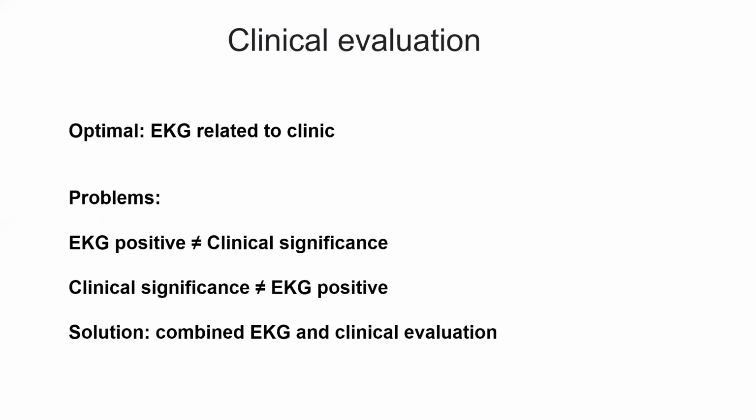That's why we always need to check the patient's condition after analyzing the EKG, to see if the patient really has the problem, whether the EKG is positive or negative. So the solution here is to combine EKG and clinical evaluation.